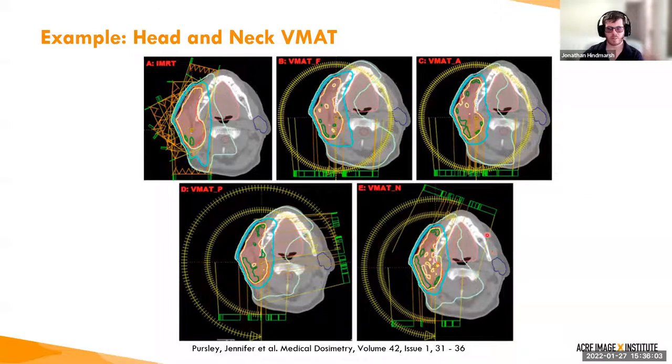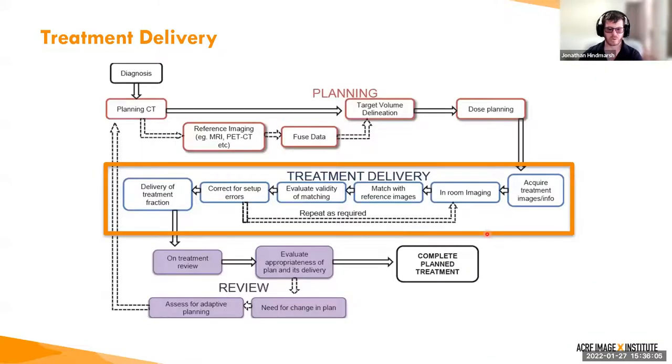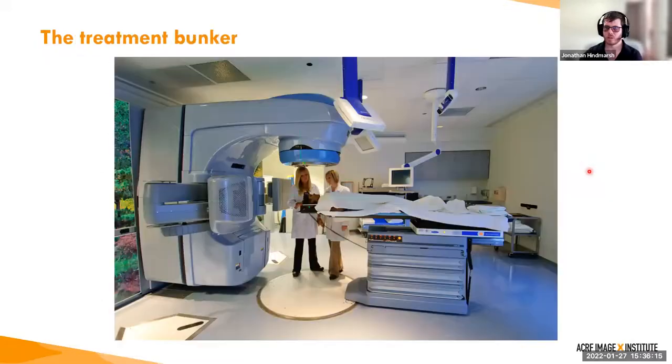So once we've got a treatment plan, we move on to treatment delivery. This is where the plan is delivered onto the patient. This is another view of a treatment bunker. This time we've got a patient on the bed.